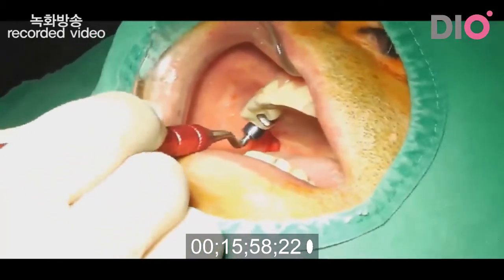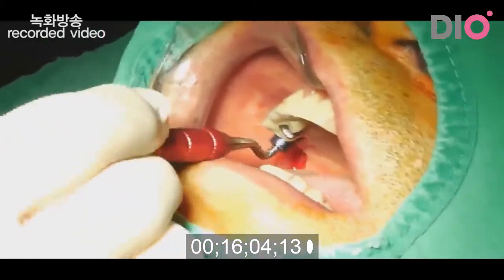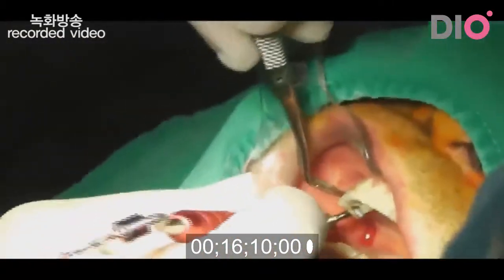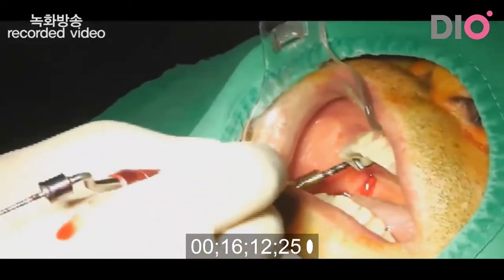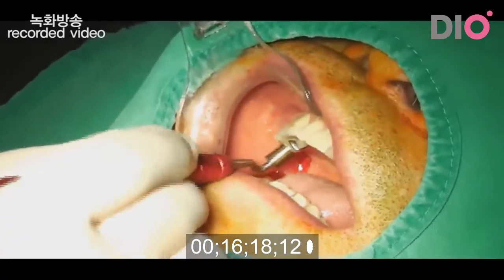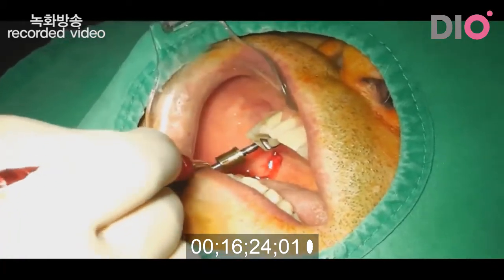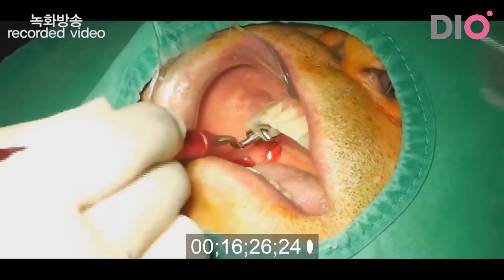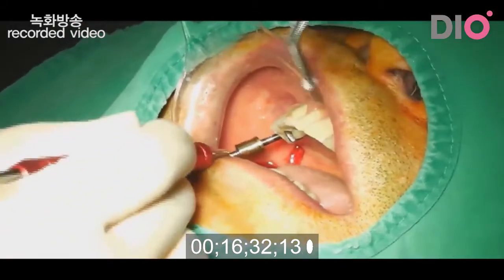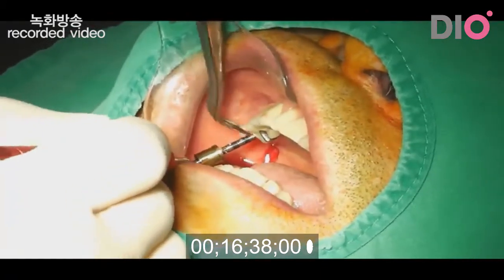It's just moving in the hole. Come the other part. Now I push the graft material into the sinus cavity, the other half of the graft material. The volume of the graft material is about 0.5 milliliters.